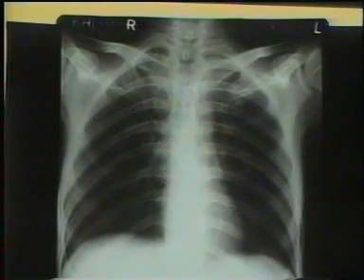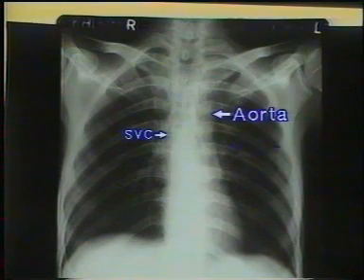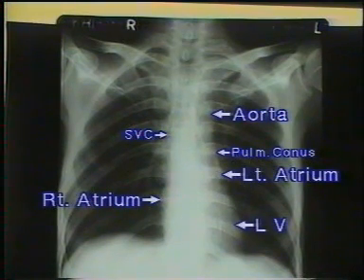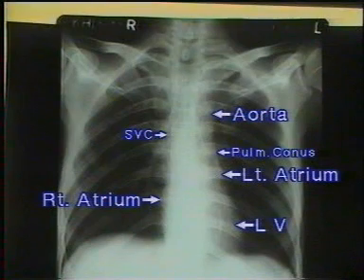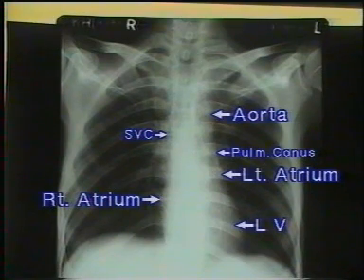Now inspect the cardiac silhouette. First study the cardiac border and measure the cardiothoracic ratio for cardiac enlargement. The left cardiac border is made of aorta, pulmonary conus, left atrial appendage, and the left ventricle. The right cardiac border is composed of superior vena cava and the right atrium. We will study the details later.